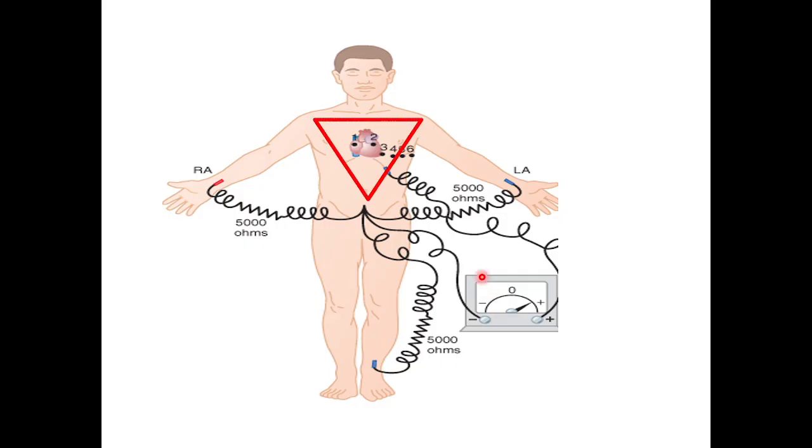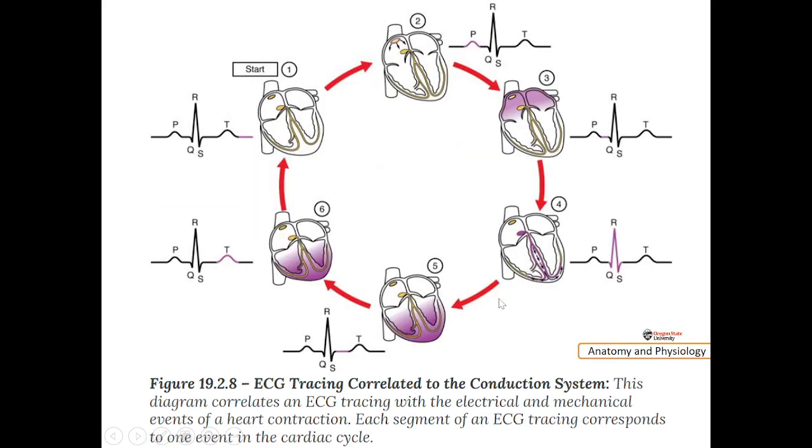This is again the ECG. The heart is in the center. How the depolarization spreads, or how these waves are produced, these QRS. As you know, the direction of the waves of depolarization is toward what? Toward the cardiac axis, the direction of the heart, downward and toward the left.